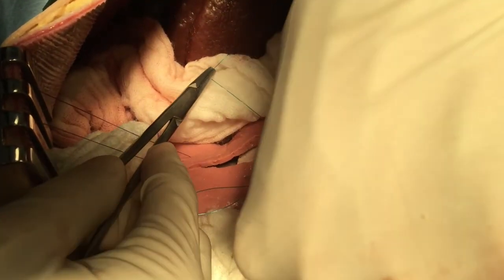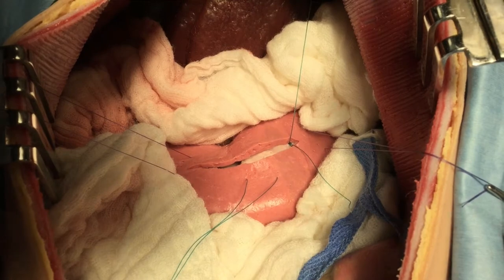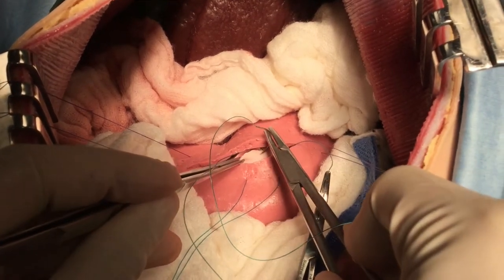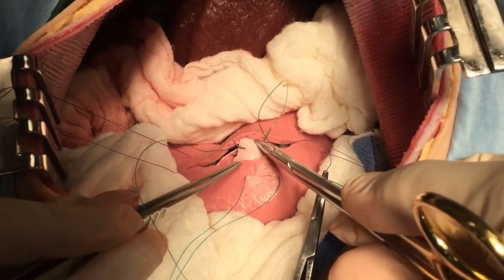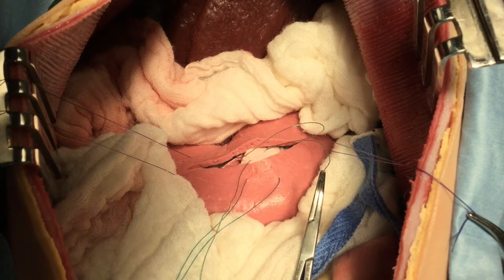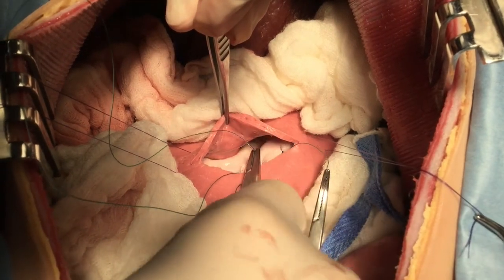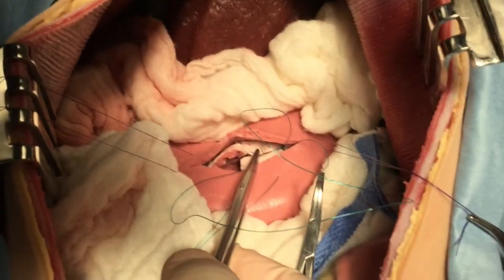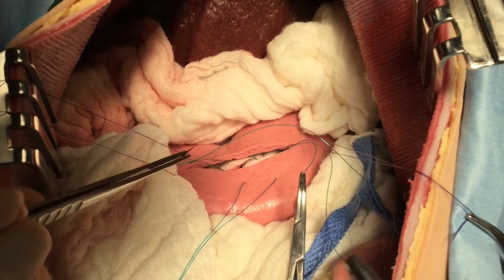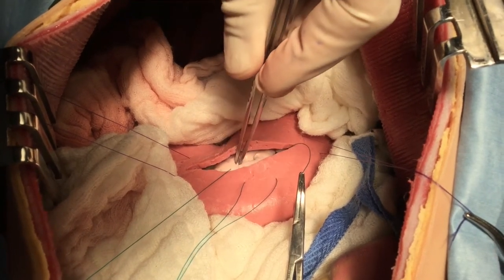Following retrieval of the foreign body, we are going to close the gastrotomy site in two layers. Separately, we are going to close the submucosal and mucosal layer. With 2-0 PDS, be sure to use a tapered needle. We are using a Connell or a Cushing pattern depending on if you penetrate full thickness into the lumen. Either one is fine, as long as we catch the submucosal layer. Bites are taken parallel to the incision on either side.